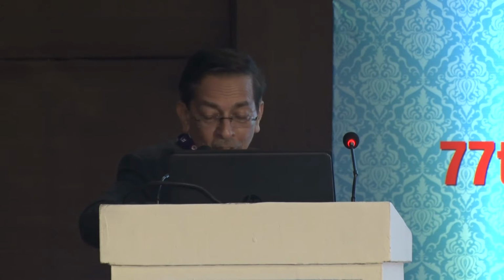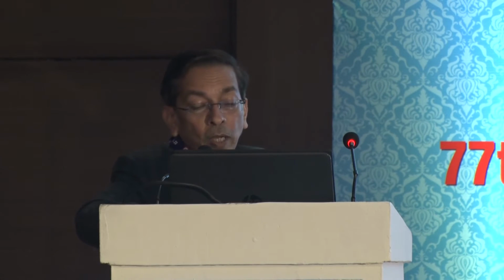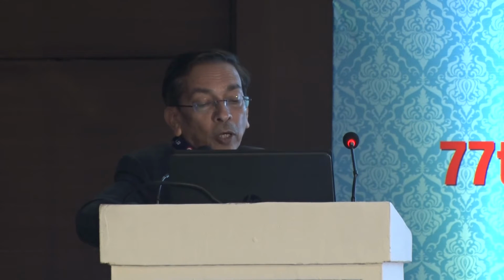Now if we increase the pupil diameter, you can see that the lens aberration increases. Means this basically is a problem in the lens. With 4.5 mm, there is total astigmatism at this. So iTrace gave a different diagnosis, that it can be rotated by 64 degrees and it will make a 5.26 diopter change in your cylindrical power. And we planned for the rotation.